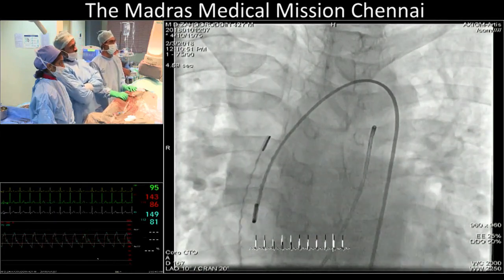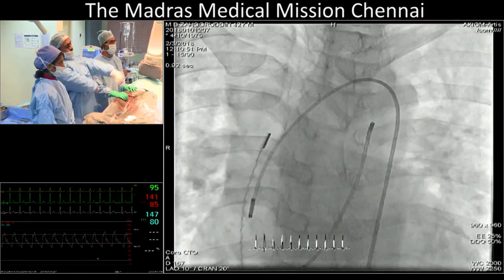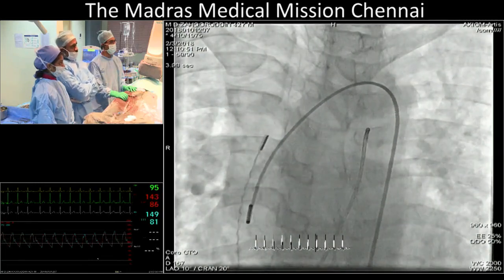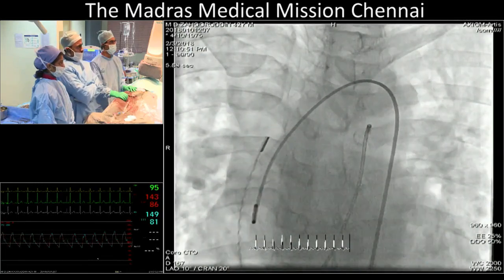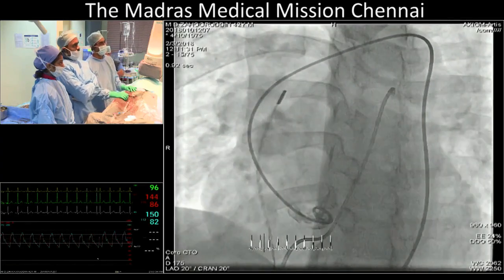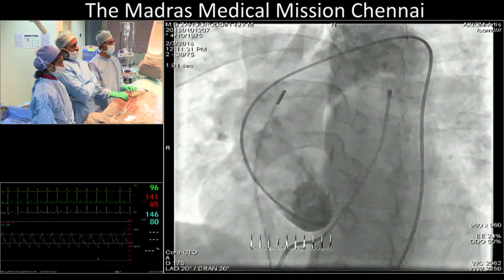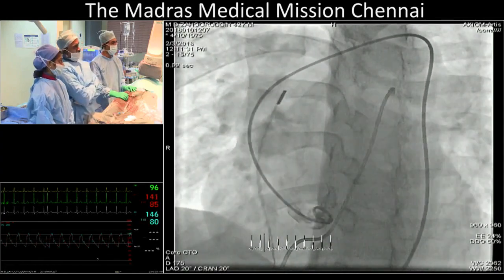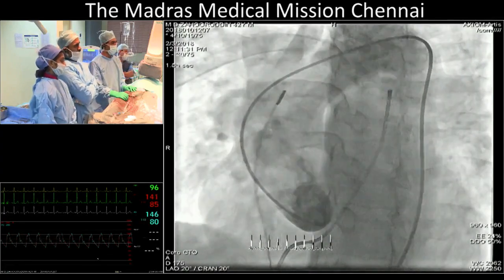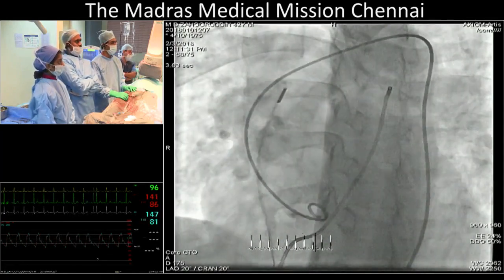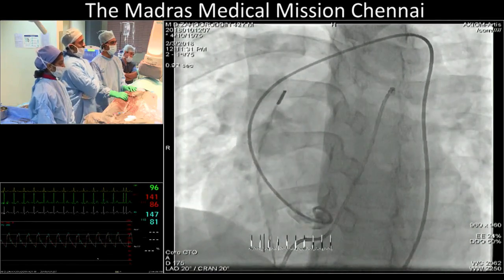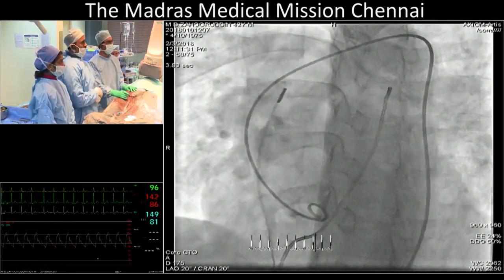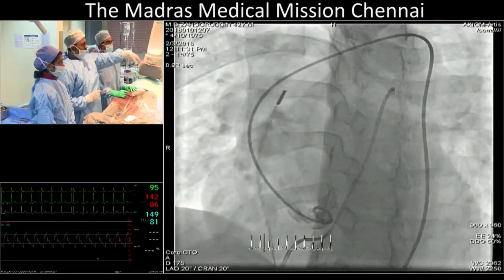We tried to get some angiography; however, with the large aorta, all the contrast gets washed away. If we change the angulation to a marginal LAO, we are able to appreciate the pulmonary artery filling, but it is not a good picture. So we are going to be entirely doing it on intracardiac echo.